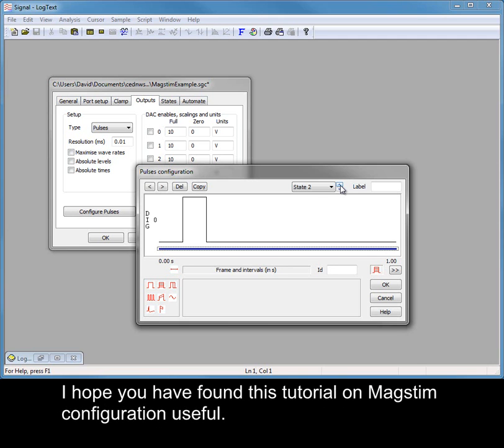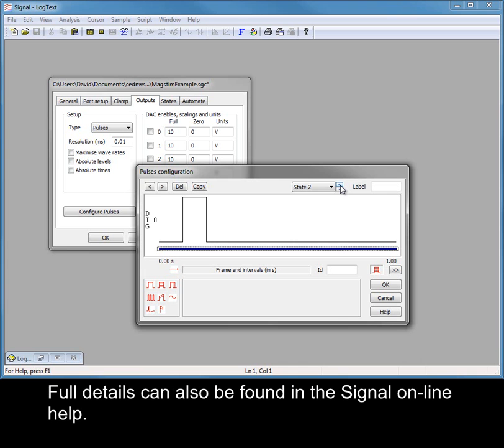I hope you have found this tutorial on MagStim configuration useful. Full details can also be found in the Signal Online Help.